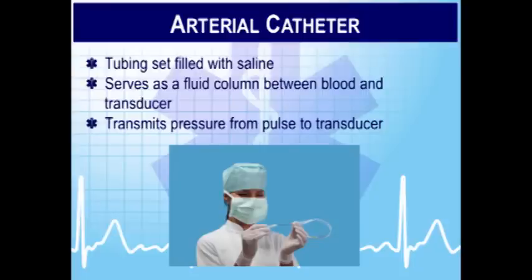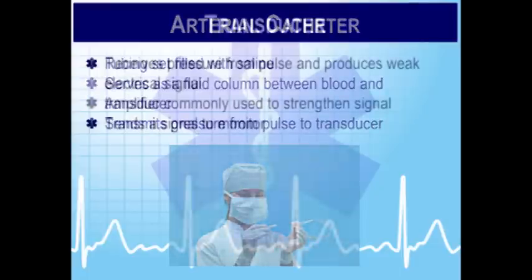If the fluid pressure goes below 300 millimeters of mercury, it's not going to infuse and the line's going to clot off, and you're going to have a really irritated ICU nurse and a really irritated physician. All right. We get excited about these lines because they're invasive. If the line clots off, that means I have to put another one in. Right? It's not like it's just easy to do that in some cases. So we get a little freakazoid about these invasive lines.